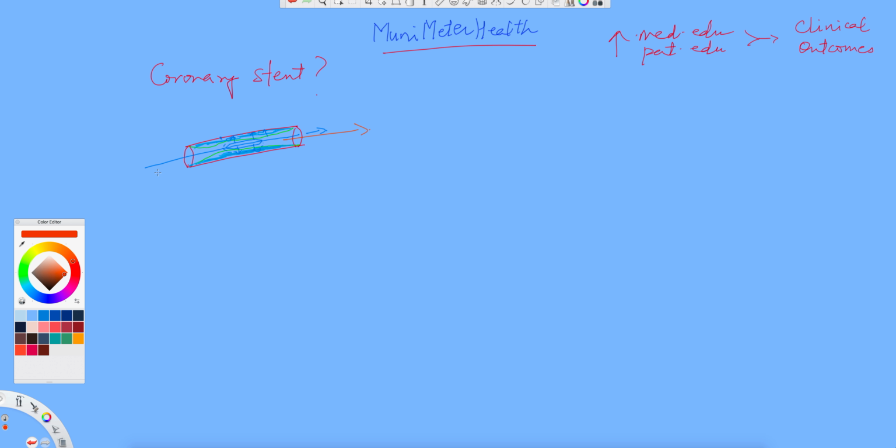So what you need to do now is remove this catheter and insert a mesh-like structure which is called the stent. It's a tubular, very fine metallic structure that is passed through again here. Now the balloon is out, remember, and now a stent is being placed. We'll show the stent in a different color. It almost looks like the metallic spring of a ballpoint pen. Remember the old-fashioned ballpoint pen refills? They had little tiny springs. That's exactly what this mesh is.